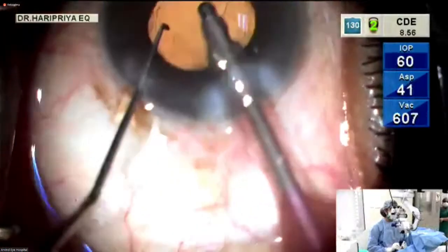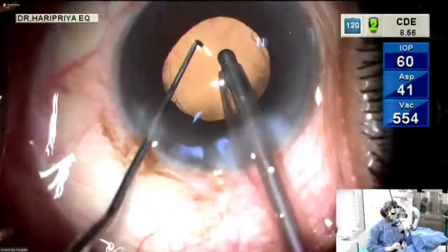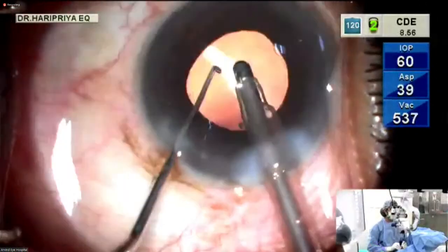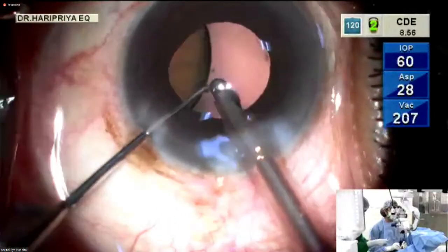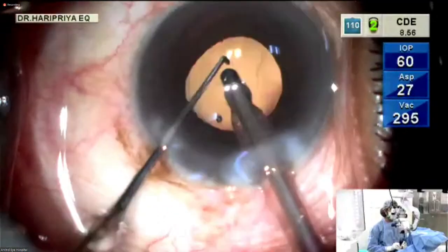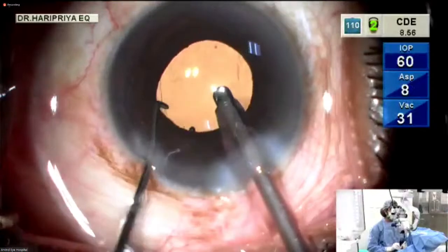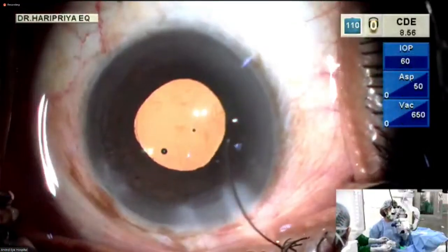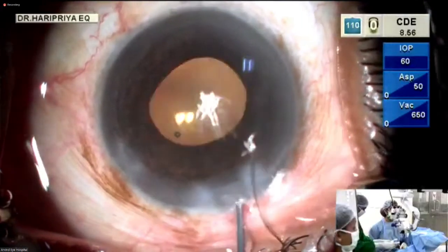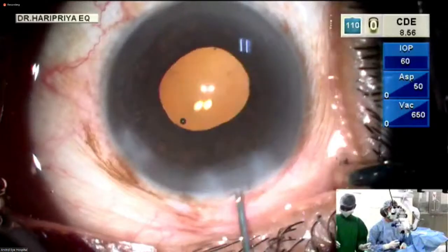Yeah. So this is the Vivity lens which has been implanted, and like I said, we have had very happy patients. Many, especially if they are early to moderate presbyopes, between age 40 to 55. Many of those presbyopes are even able to see N6 with the Vivity lens. For patients beyond that, who have more than 1.5 or 2 diopters of presbyopia, they probably need a little addition for near vision. But otherwise, I think it probably has something to do with the little accommodation they already have. So they have good vision for distance, intermediate, and near.